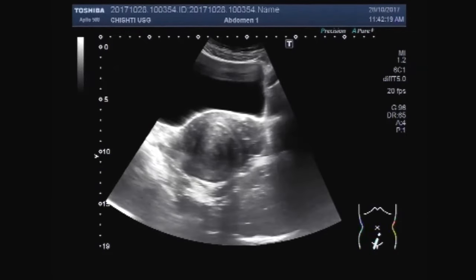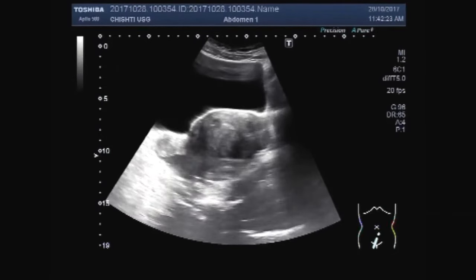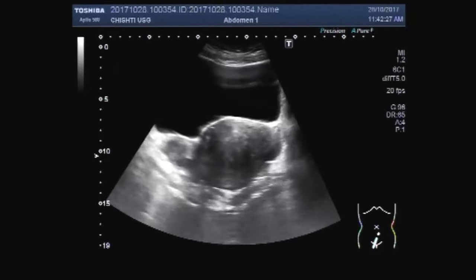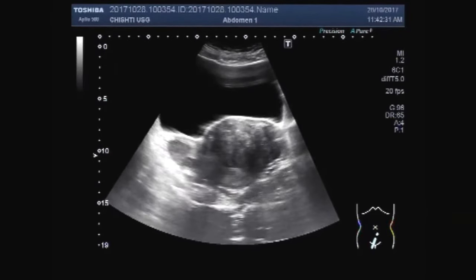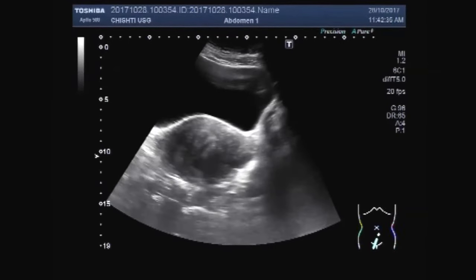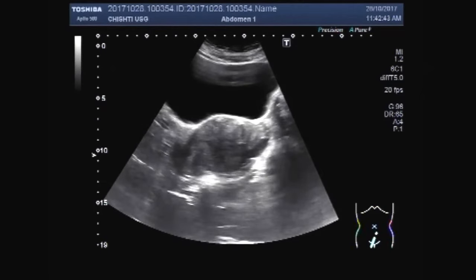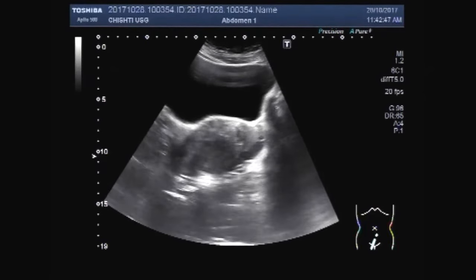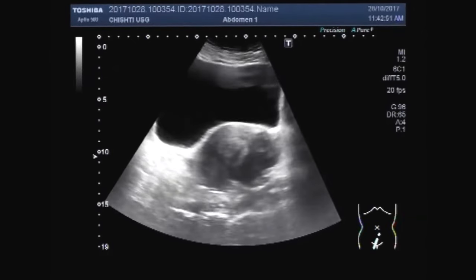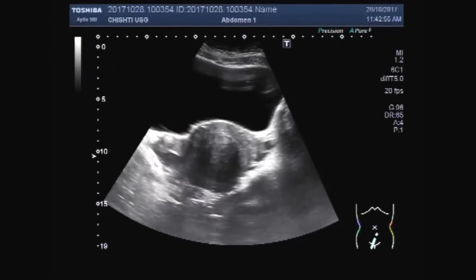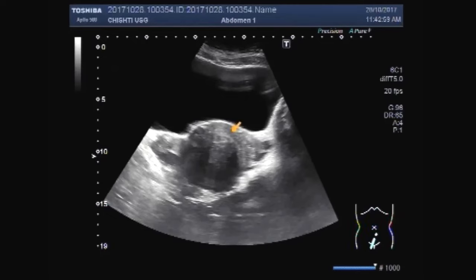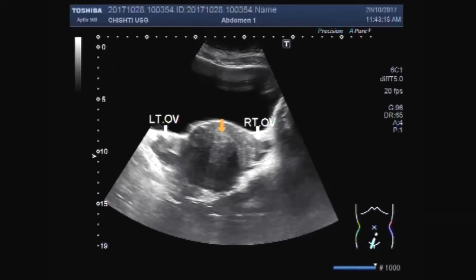Both masses in the uterus and both ovaries are visualized. The right ovary is larger compared to the left one and has a significant amount of inflammatory fluid in its interior. This is the left ovary; this is the right ovary. This is the uterus and urinary bladder.